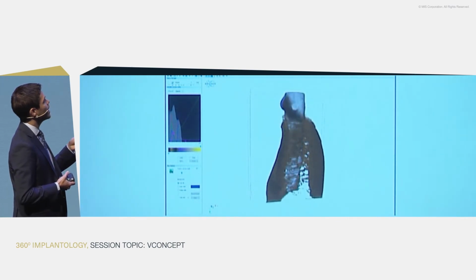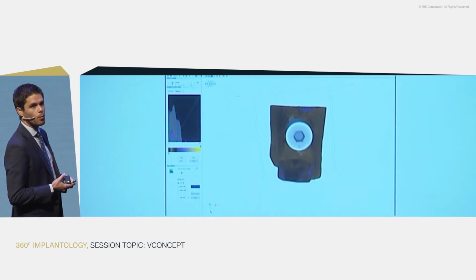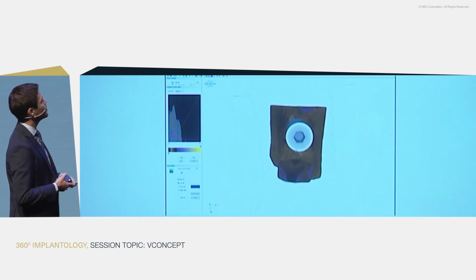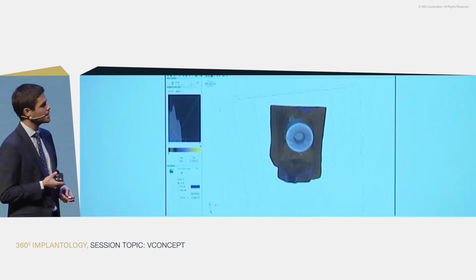Not only that, we have the opportunity as well of rotating these 3D reconstructions and checking from up above what is the bone width on the buccal. You can very well appreciate here the implant design and the thread pattern. But the question remains of whether this is just a nice image that we can enjoy our view and our sight with, or whether we can actually get valuable objective data from these measurements, as we always discuss.